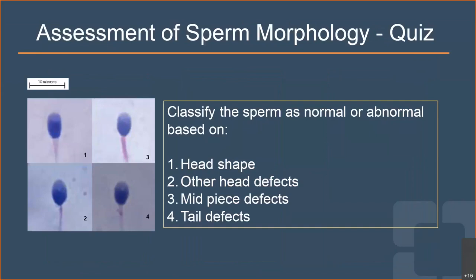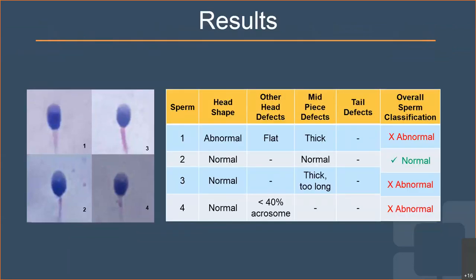A short quiz presents four images classified by head shape, head defects, midpiece defects, and tail defects, asking participants to classify each as normal or abnormal in 20 seconds. Reviewing the answers: looking at image number one, examining the head to determine classification.